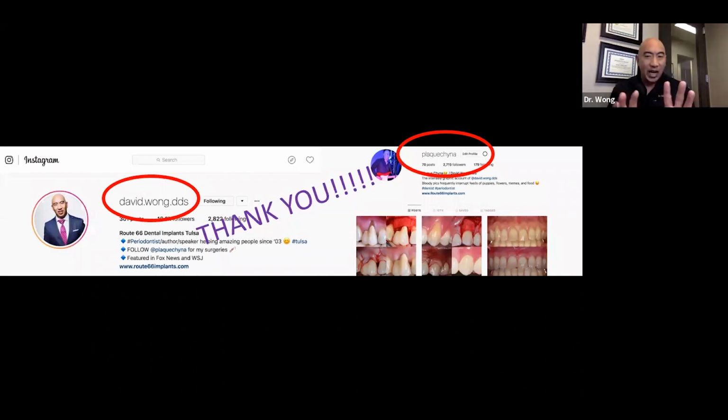Yeah. Okay. So that's actually an easy question to answer. Your membrane is on the inside of the socket. So when you're engaged, you always go through the labial side first of the soft tissue. The tip of your needle is going to hit the labial plate first, and then slide on up. Your membrane's on the inside of the socket, so that should never be an issue. If for whatever reason it's still an issue, I couldn't imagine how, but if it is, what I would do is make your first bite more lateral, off to the mesial or the distal, so you get laterally away from the membrane.